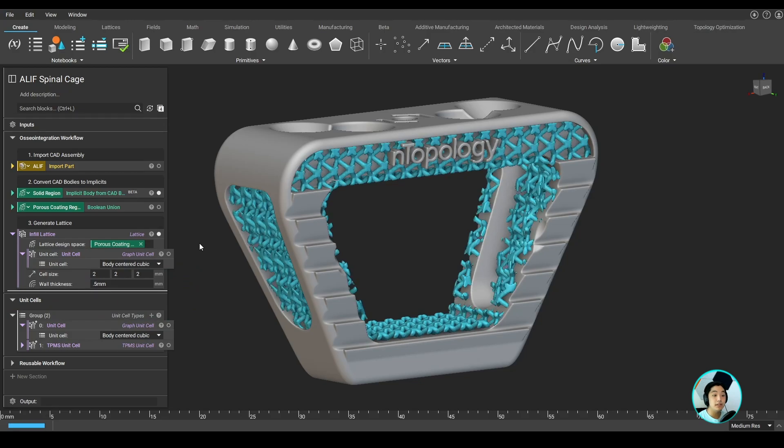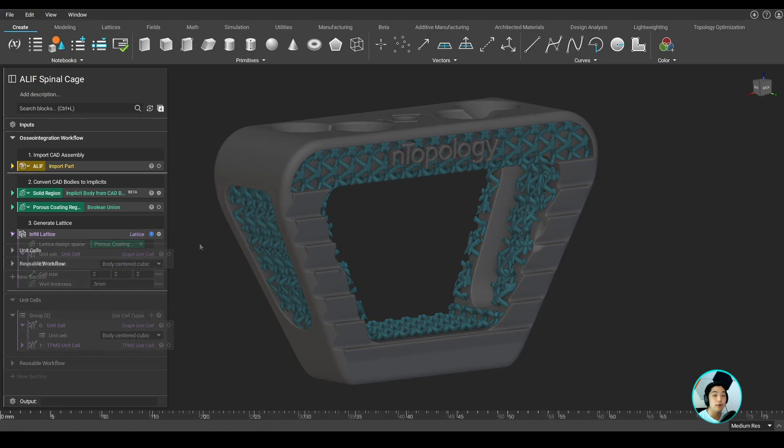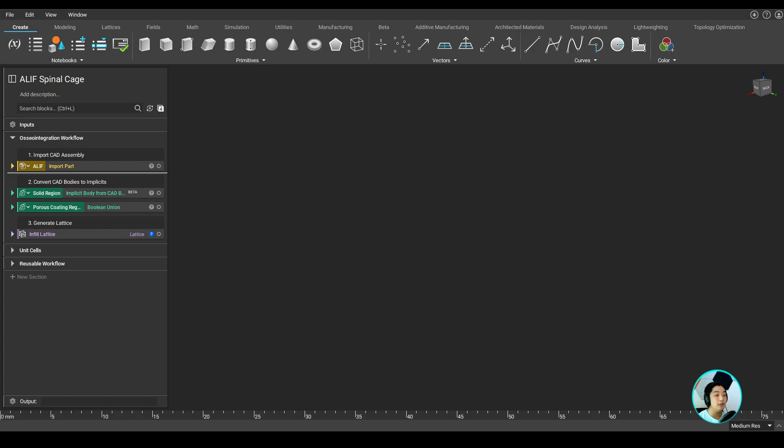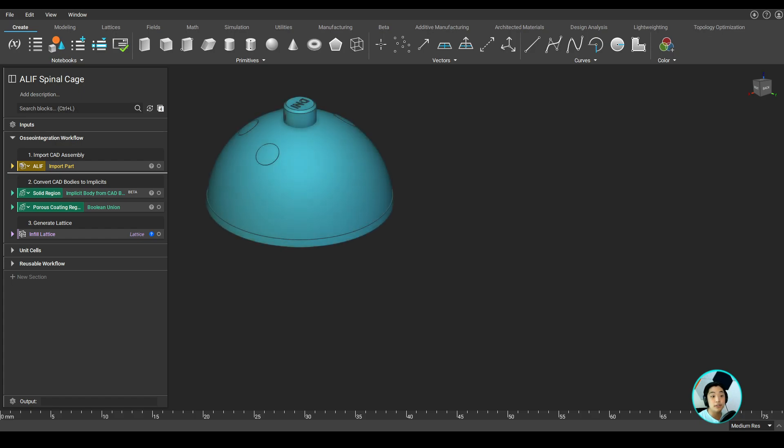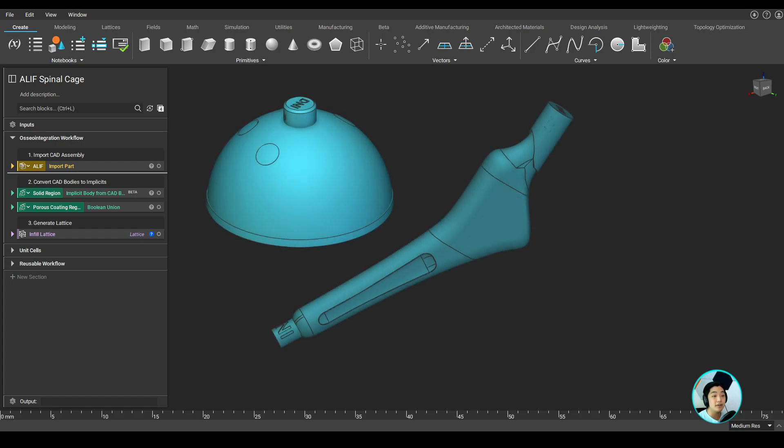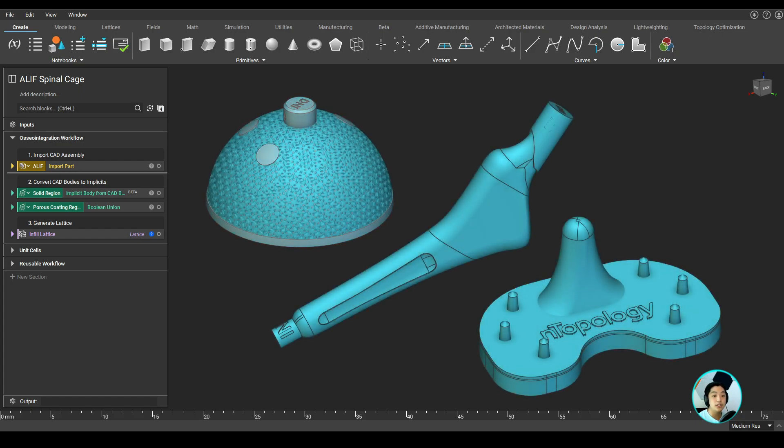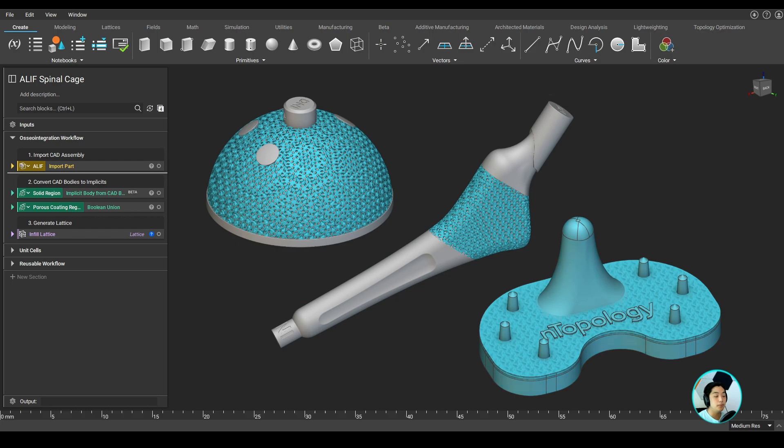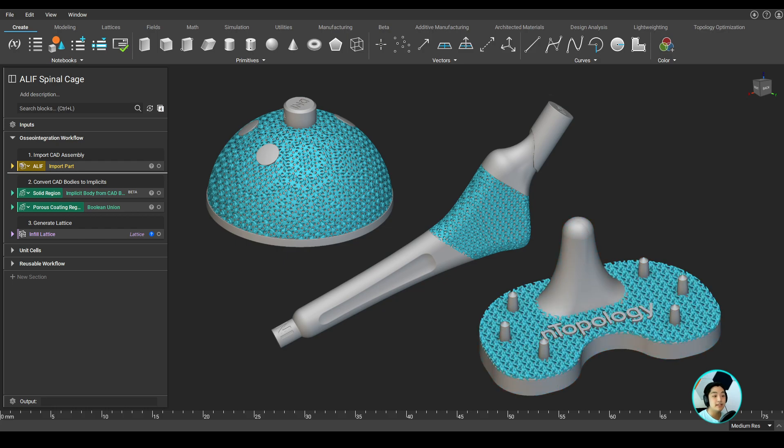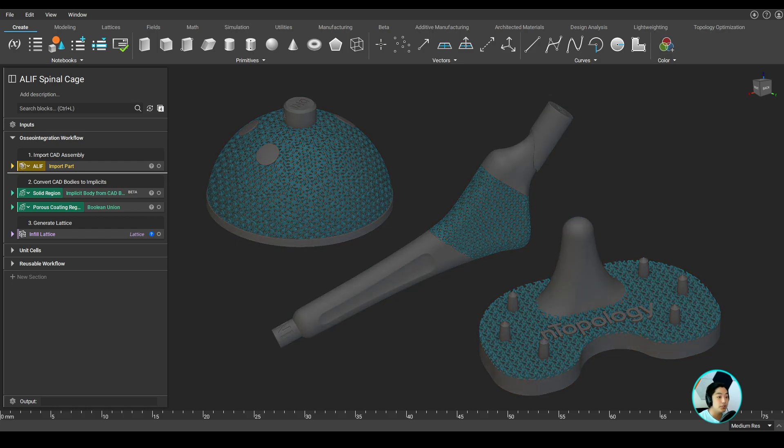Now, in terms of scalability, we have applied a single lattice structure to a single part. If we had a larger product family or an entirely different product line, nTopology enables the redeployment of your lattice design workflow to any other part you wish.